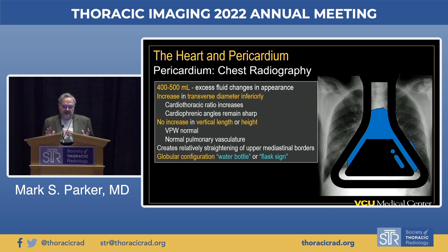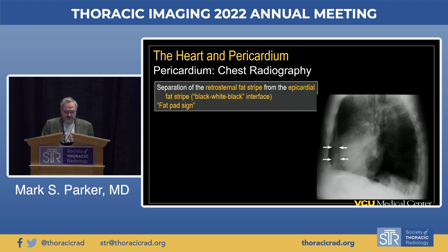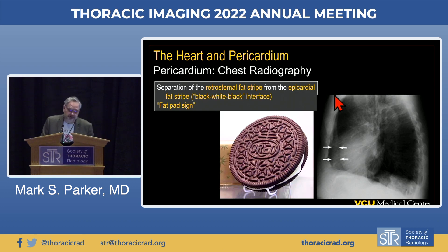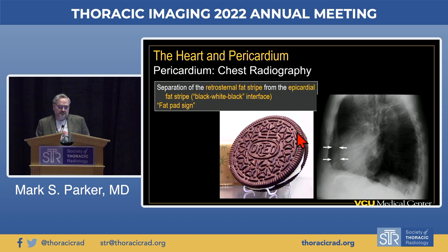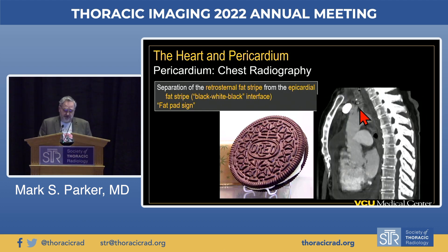Two signs reflective of pericardial effusion or cardiomyopathy to keep in mind. On the lateral examination, we see separation of the black epicardial fat stripe from the black retrosternal fat stripe by an intervening layer of white fluid—referred to as the fat pad sign or the Oreo cookie sign: two black cookie layers (epicardial and retrosternal fat stripes) with the intervening fluffy pericardial effusion. On the sagittal CT reconstruction, we can directly see the fluid enveloping the myocardium between the two fat stripes.